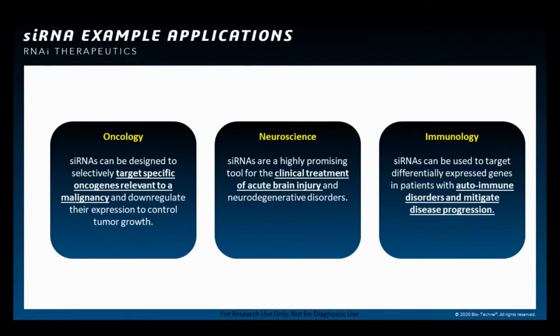Next, we're going to switch gears and talk about a different class of small non-coding regulatory RNAs, and these are the synthetic type, and how the miRNAscope assay can address this particular application. These are the small interfering RNAs, or siRNAs, and as mentioned, they're synthetically designed, and they can target a particular RNA of interest. In many cases, those targets include transcripts whose aberrant expression can lead to a particular disease state. Now, it's been envisioned that in the next few years, many siRNA therapeutics will be entering the clinic to treat a number of diseases.